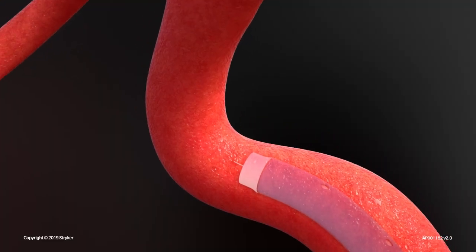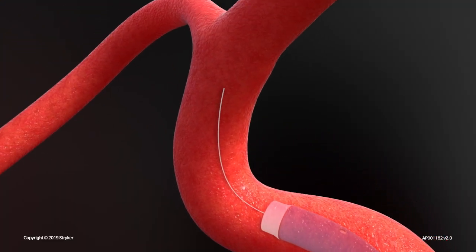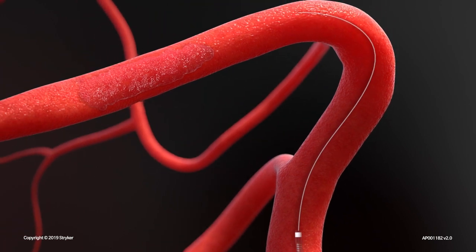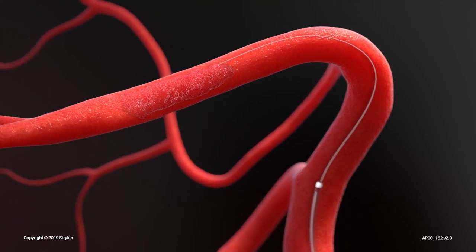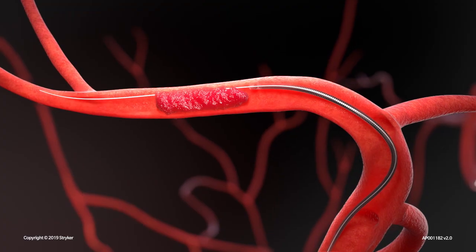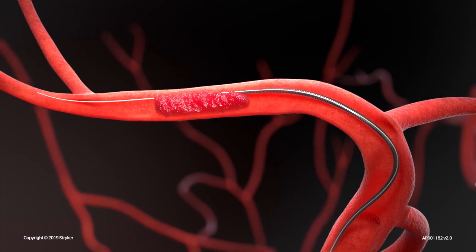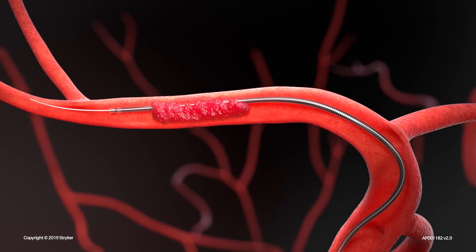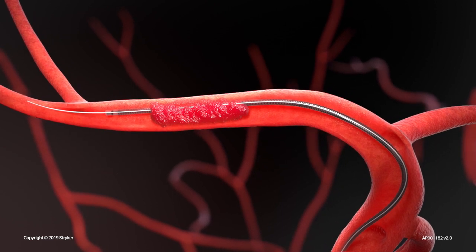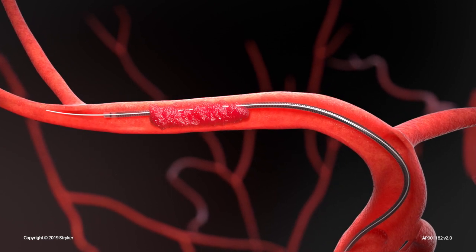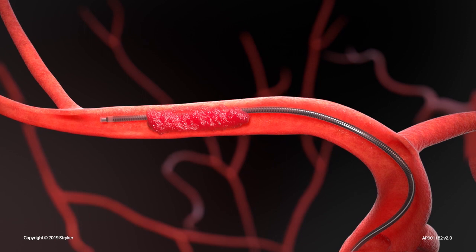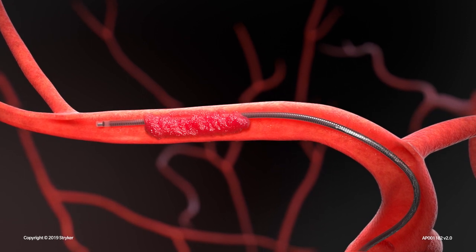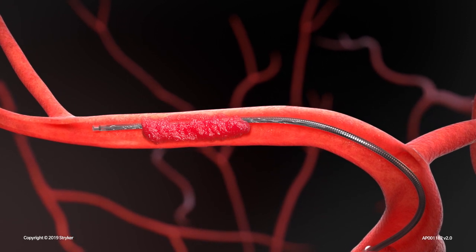The balloon guide catheter helps control blood flow to the brain during the retrieval procedure. With the aid of a guide wire, the microcatheter is advanced through the occlusion and positioned distal to the clot. The guide wire is then removed and the Trivo Retriever is advanced through the microcatheter.